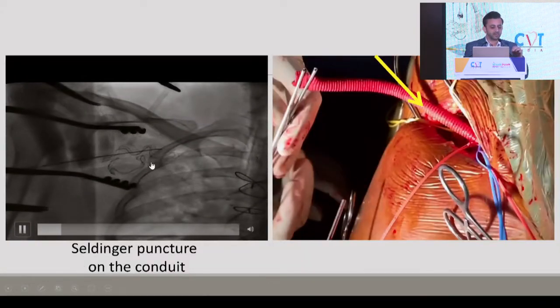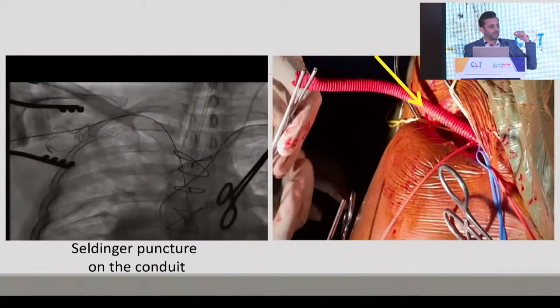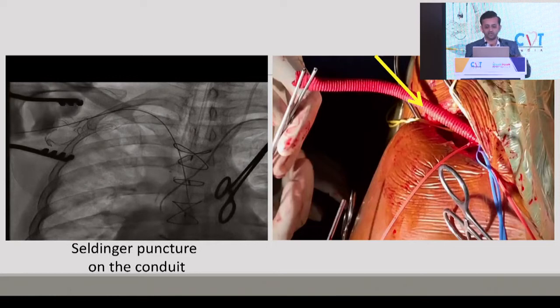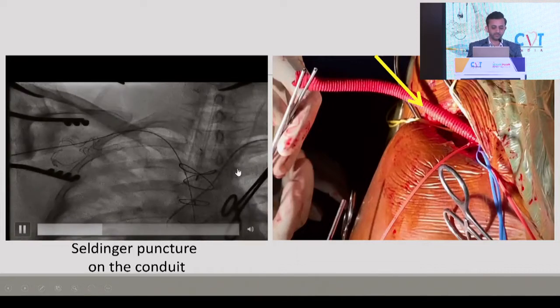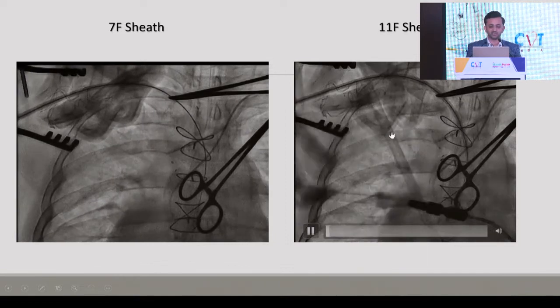This is a typical Seldinger puncture. So this Dacron graft will have an open end, but you can't work from there because otherwise it will keep bleeding. So we clamped it and we punctured the Dacron graft as if it was a femoral artery with a direct Seldinger needle. We punctured the graft over here where the marker is, and this is a wire going in from the right subclavian. We dilated the puncture site first with a 7 French sheath and then with an 11 French sheath.